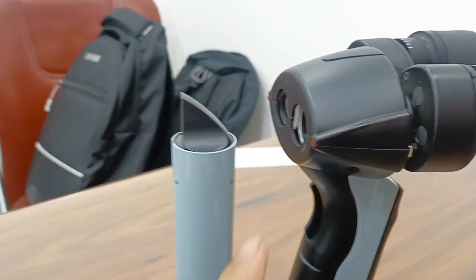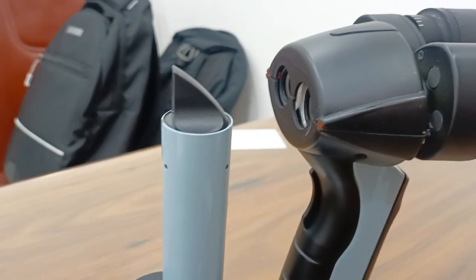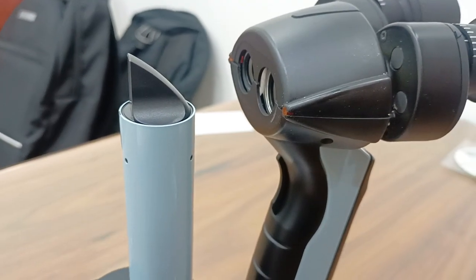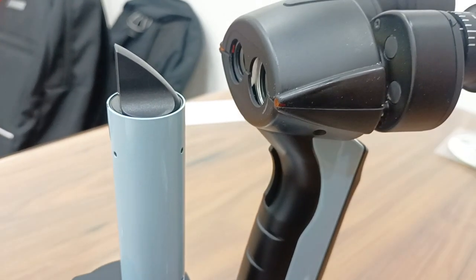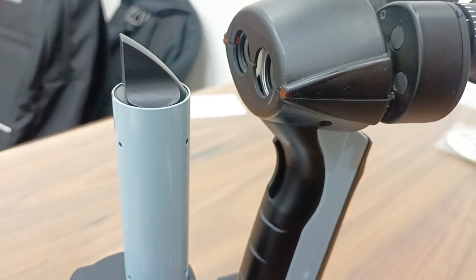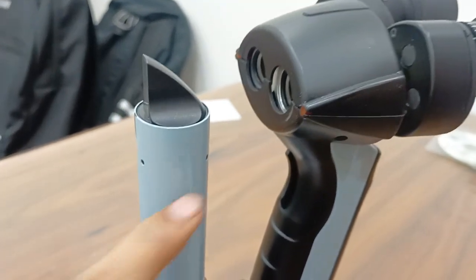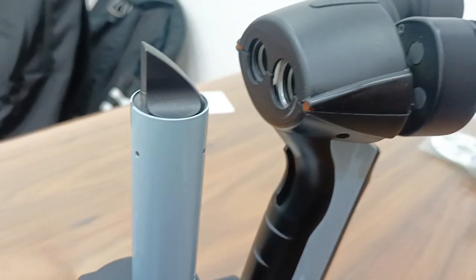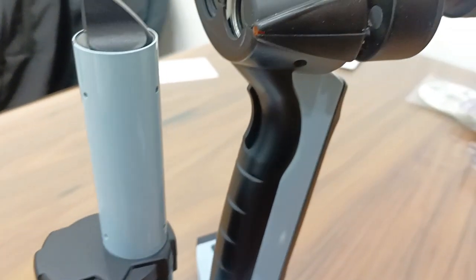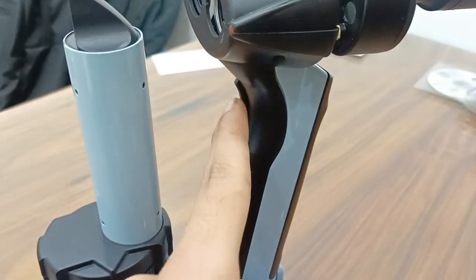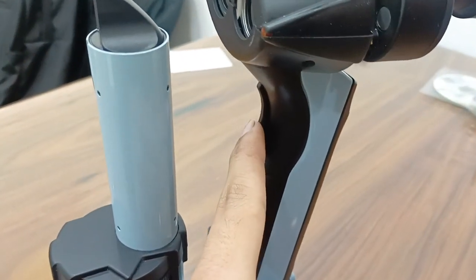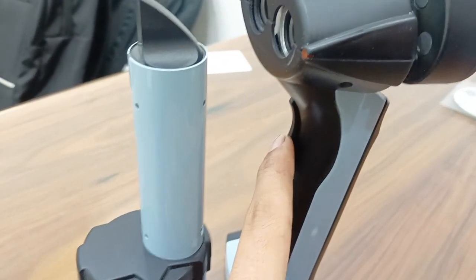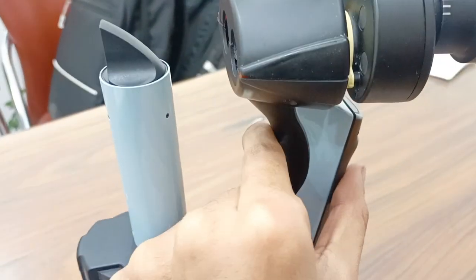Fixation target light - the patient has to look here during examination. To turn on the slit lamp, you have to double-click the trigger.